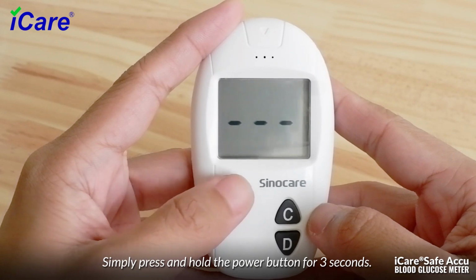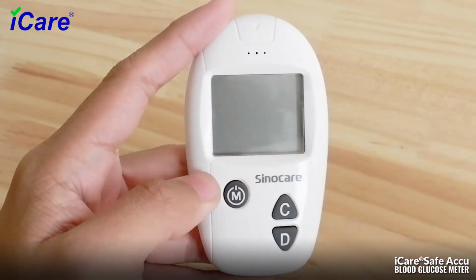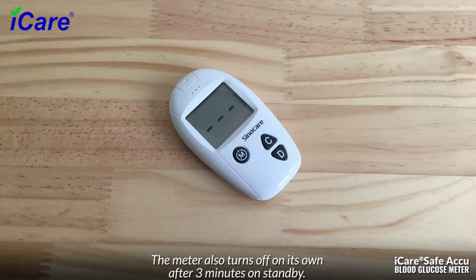Turning off the device. Simply press and hold the power button for 3 seconds. The meter also turns off on its own after 3 minutes on standby.